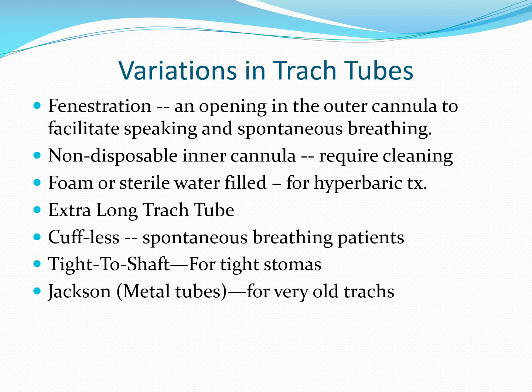The idea there is some folks have very narrow stomas. You have less risk of the wrinkles, if you will, or folds in the cuff interfering with a cuff tube change. So individuals that have had problems in the past may be switched over to a tight to shaft to better facilitate the insertion and the changing of tracheostomy tubes.